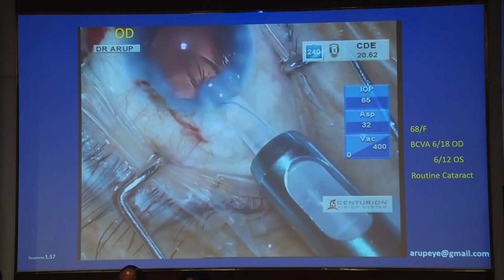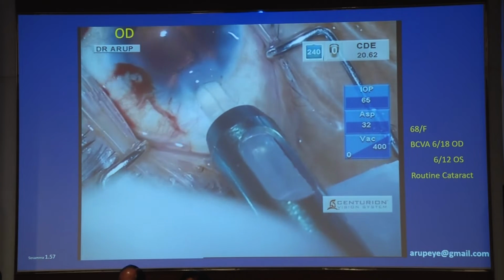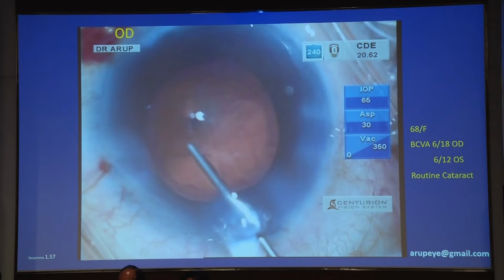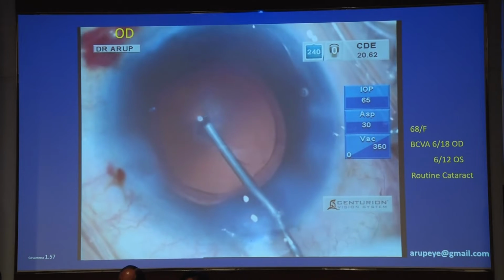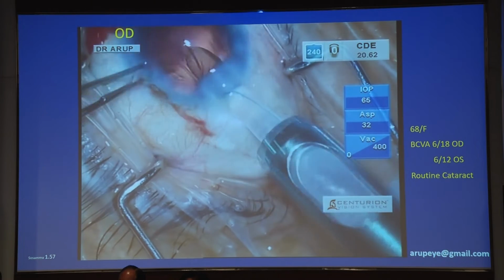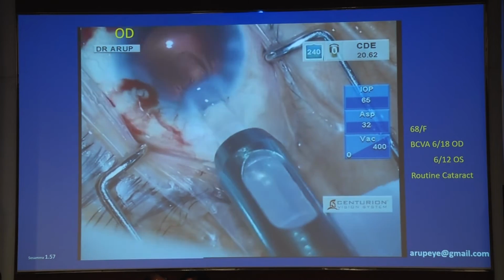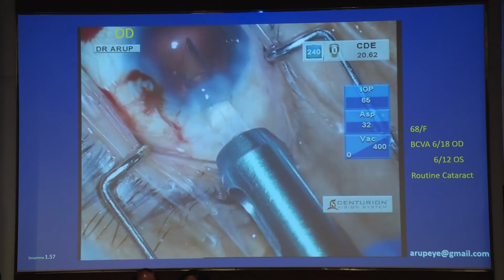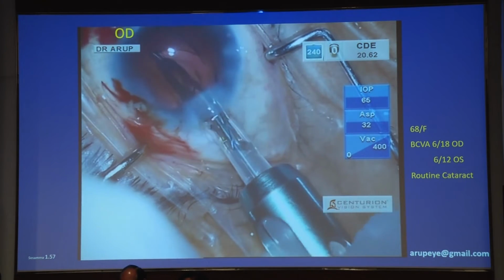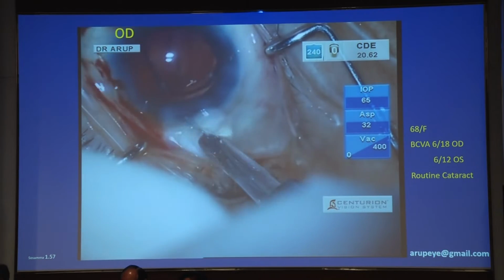Now, this was a 2.8 millimeter incision topical clear corneal approach surgery, and the leading haptic is going in. So this surgery has gone off extremely smoothly. There's no intraoperative complication so far. And then I am squeezing the lens. It is a Sensar AR40E, which goes into the anterior chamber. So the leading haptic goes in pretty smoothly so far, as you see here. And most of the lens has been delivered within the capsular bag. It is just the trailing haptic that has to be dialed into the capsular bag.